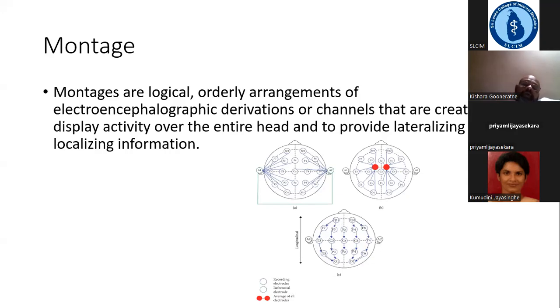So there are various patterns that we use to measure the potential against other electrodes, and this pattern is called a montage.